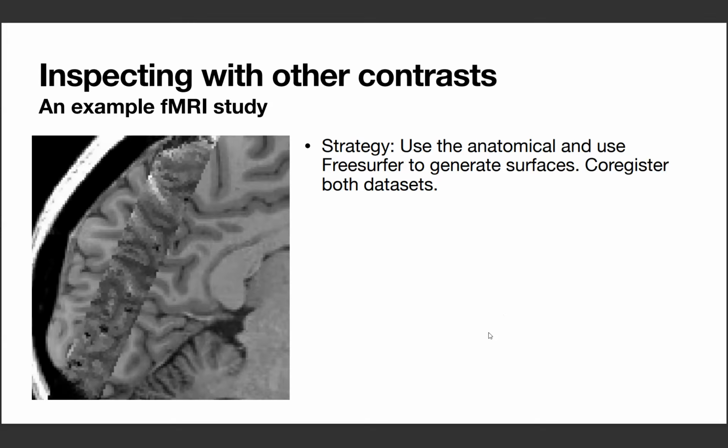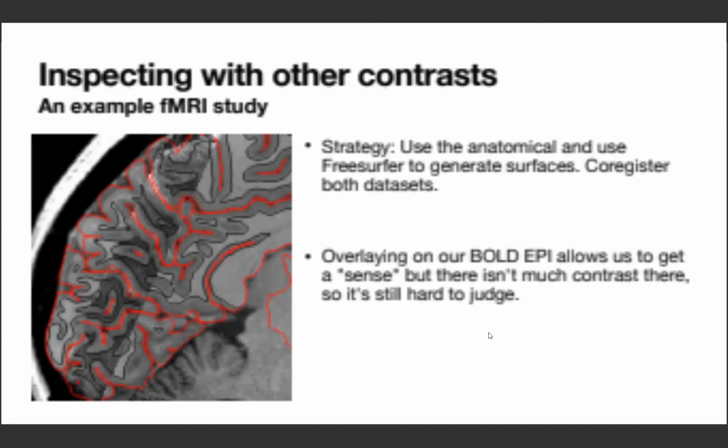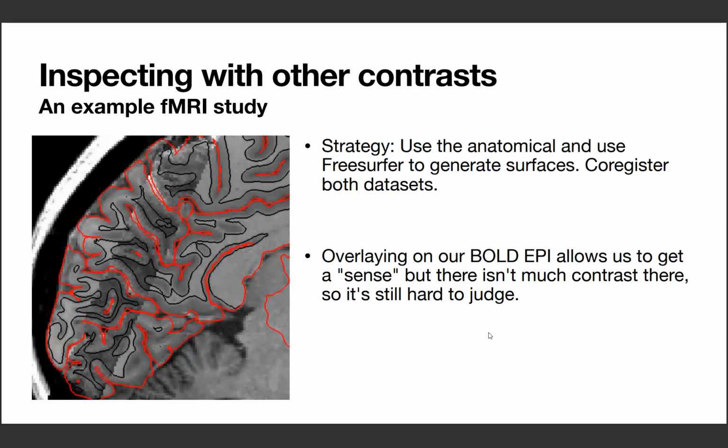And we use FreeSurfer to generate the surfaces. So if we do this, and this is what it looks like, we can maybe look here and judge: does this work? Is this okay? Are the surfaces well positioned? But it's still hard to judge.